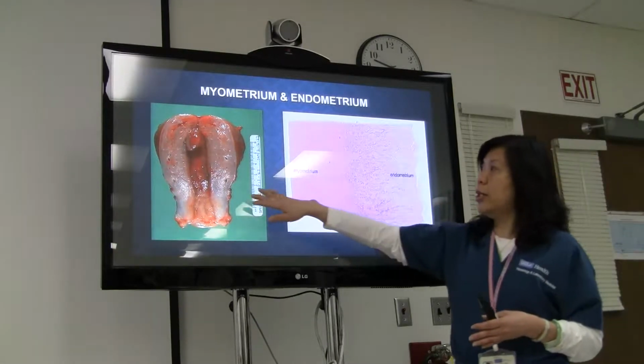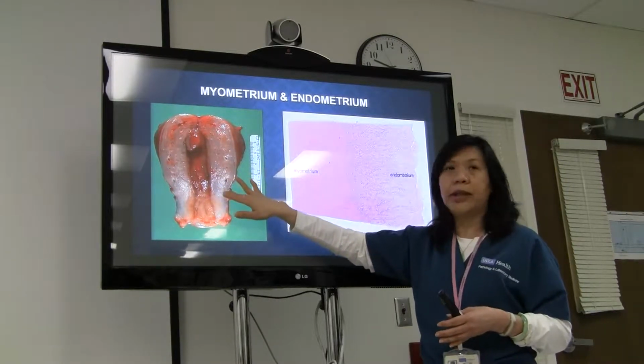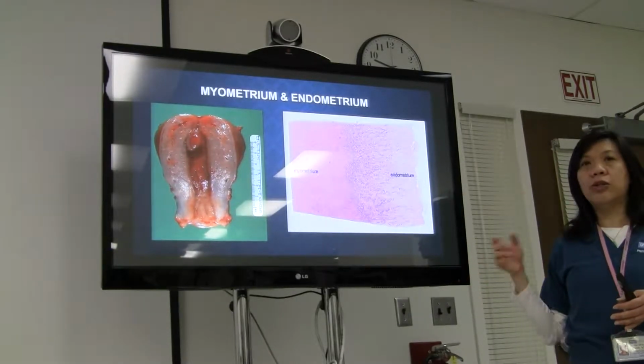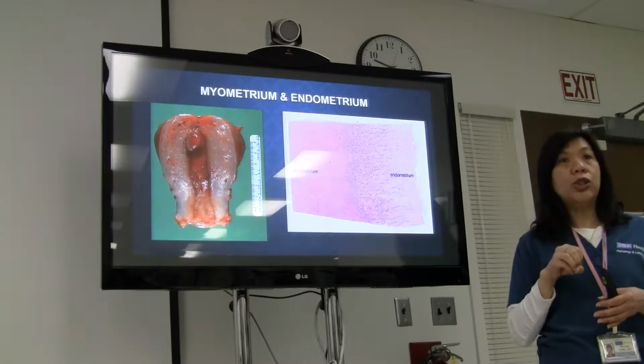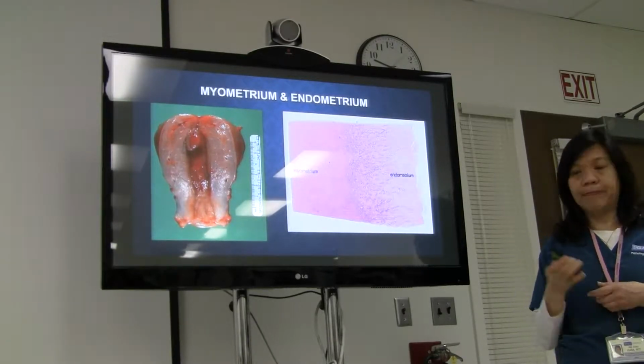In order for us to be able to see so deep, it has to be something eroded down that we will see. Otherwise, they need to submit it to histology. They actually use a knife, a little biopsy instrument, to get a chunk of the tissue off. Okay, without just scraping it, we will not be able to see it.